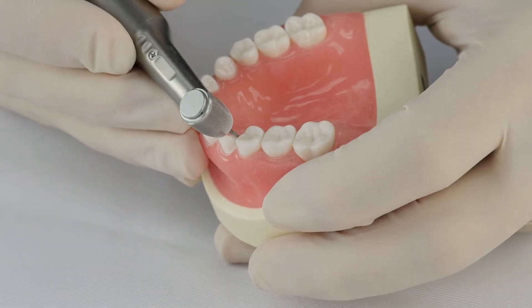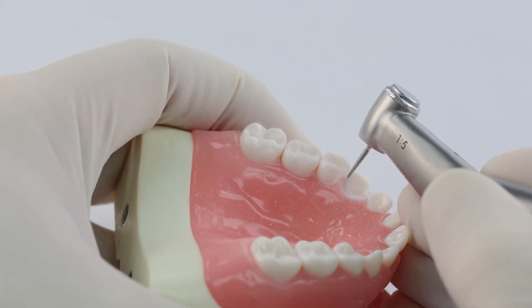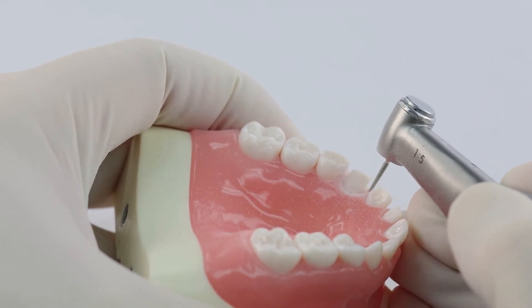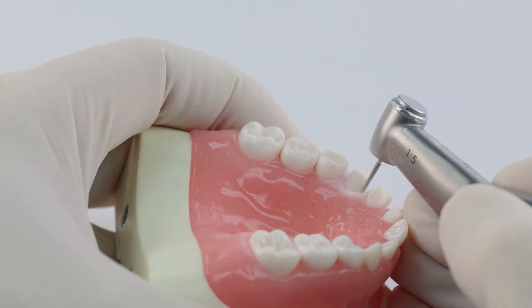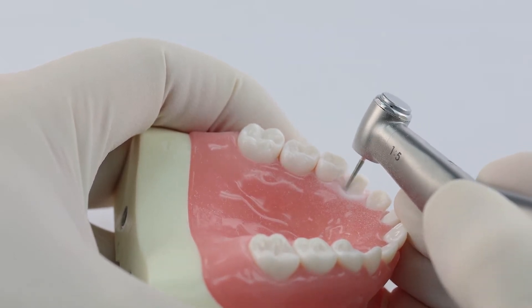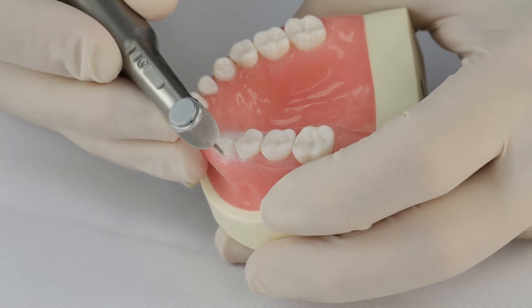Now I'm going to do the lingual. Once again, you want to create a line right at the tissue level, then go back in and thicken that line and develop your racetrack as you go around.